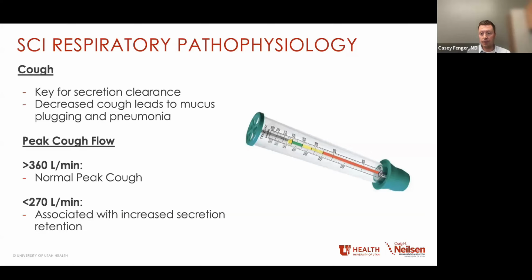And so this device here is actually a meter that you can use to measure peak cough flow. It's something that respiratory therapy does quite a bit. If you're on rotation or you're with pulmonology or in inpatient rehab, I recommend talking to some respiratory therapists and watch them do some of these tests on patients, do them on yourself so you can see what they're like.